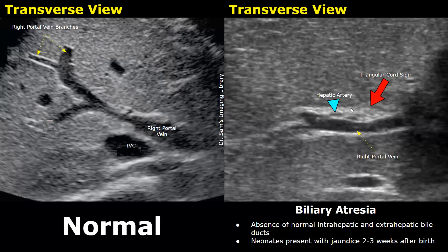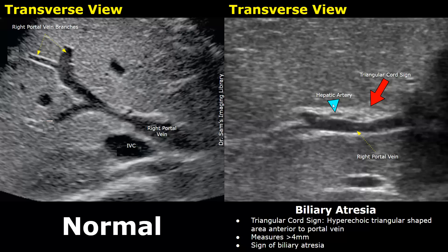Biliary atresia is a rare pathology in which there is absence of normal intrahepatic and extrahepatic bile ducts. Newborns can present with jaundice two to three weeks after birth. On ultrasound, one specific feature is the triangular cord sign — a hyperechoic triangular-shaped area anterior to the portal vein.